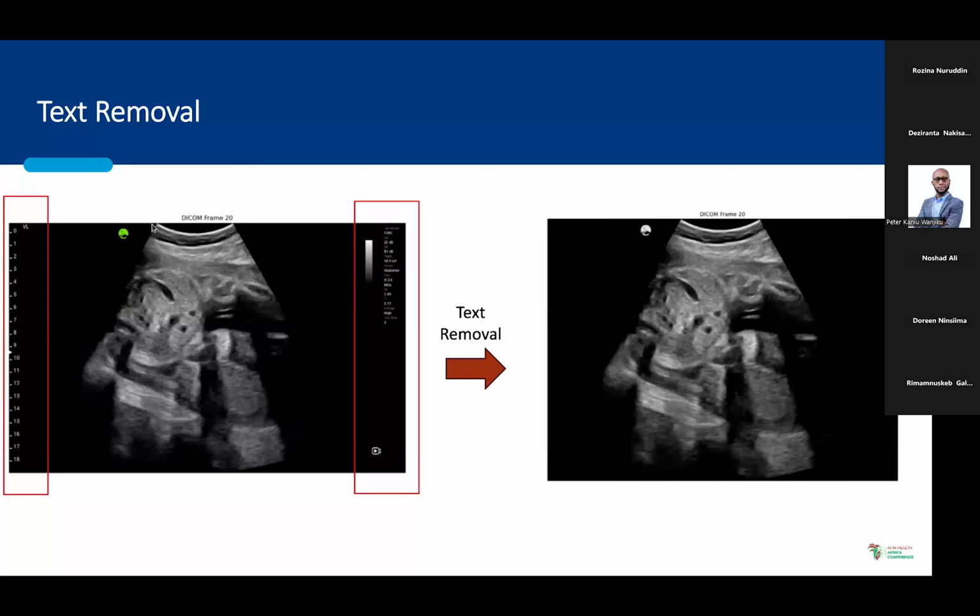So you could remove those sorts of texts before you train with your model. And there is also often this blob on the imaging. This shows that where the blob is present, this is the right of the patient.